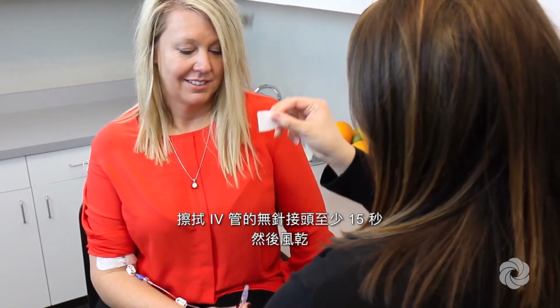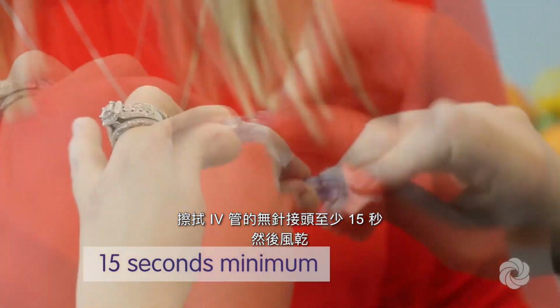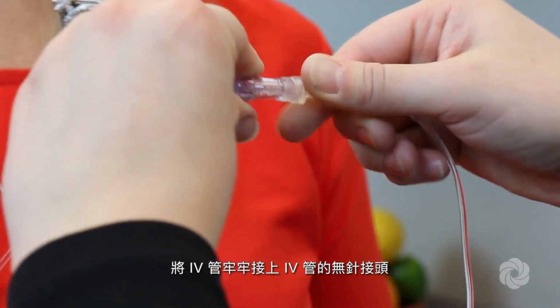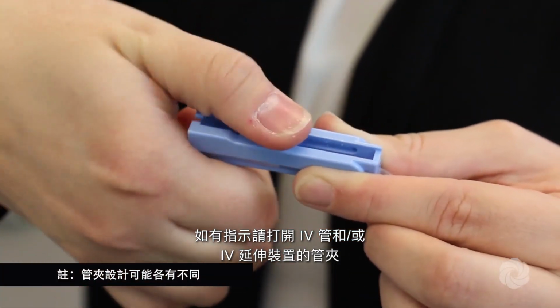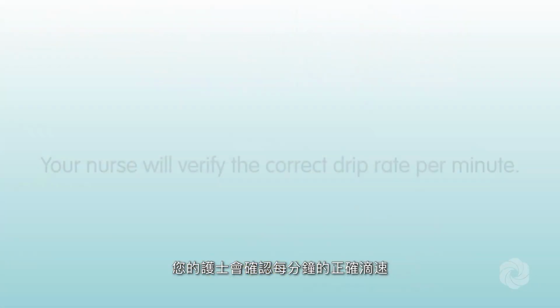Scrub the needleless connector on your IV catheter for at least 15 seconds and allow to air dry. Remove the protective cap from the IV tubing. Attach the IV tubing firmly to the needleless connector on your IV catheter. Open the clamp on your IV catheter and/or extension set, if indicated. You should see drops fall into the drip chamber as your medication begins infusing. Your nurse will verify the correct drip rate per minute.